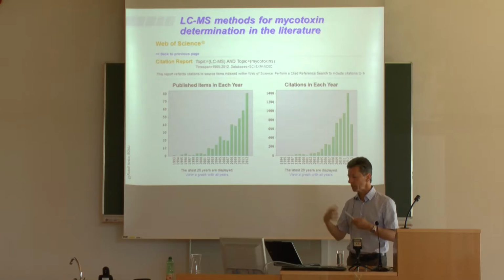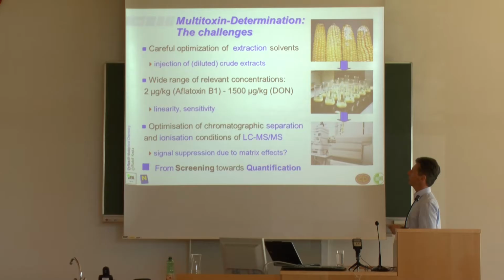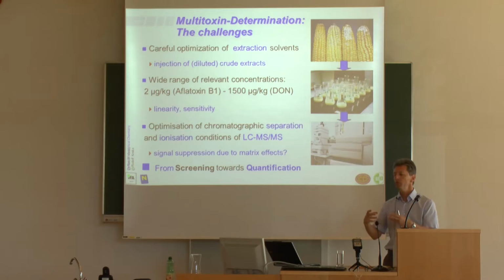However, there are a couple of challenges which have to be met. Careful optimization of the extraction solvent, I've alluded to that before, because we are injecting actually the diluted crude extract.